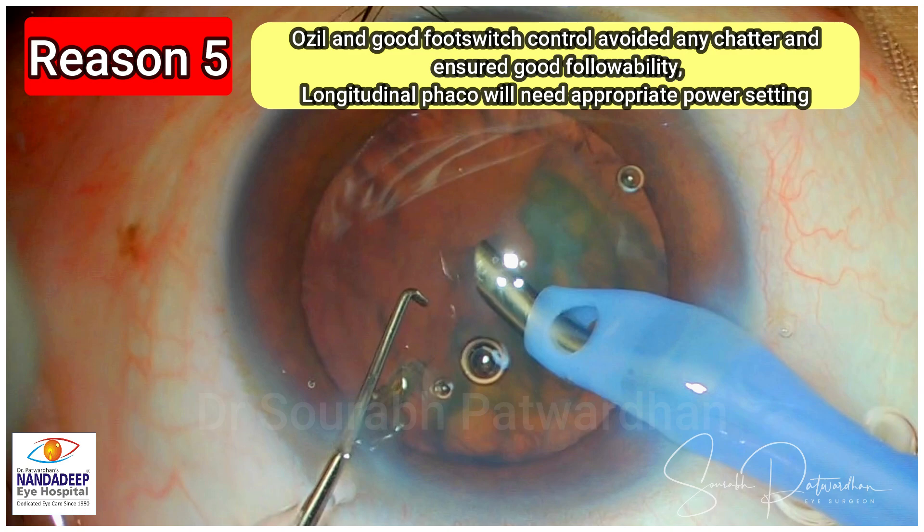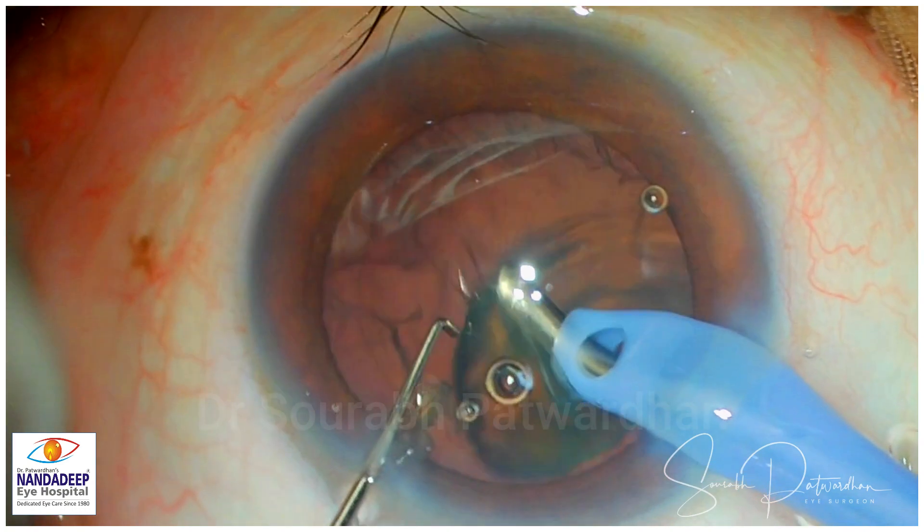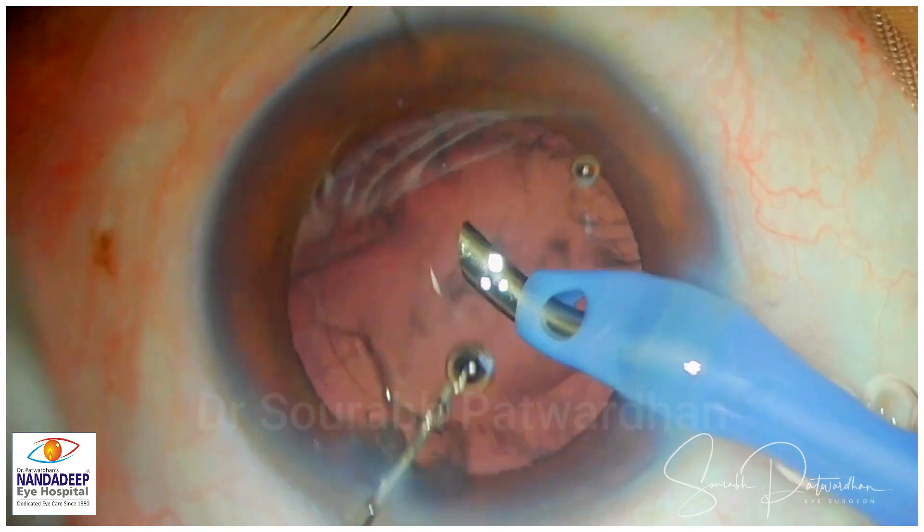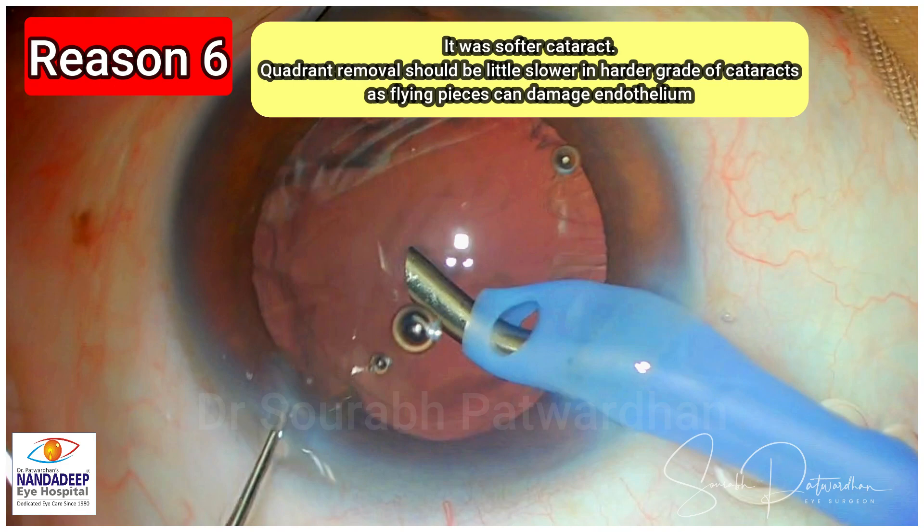With longitudinal phaco, we will need appropriate power settings and good foot switch control — avoid excess power or too low power. It was a softer grade of cataract, so quadrant removal should be a little slower in harder grades of cataract as the flying pieces can damage the endothelium. So there is no need to hurry.